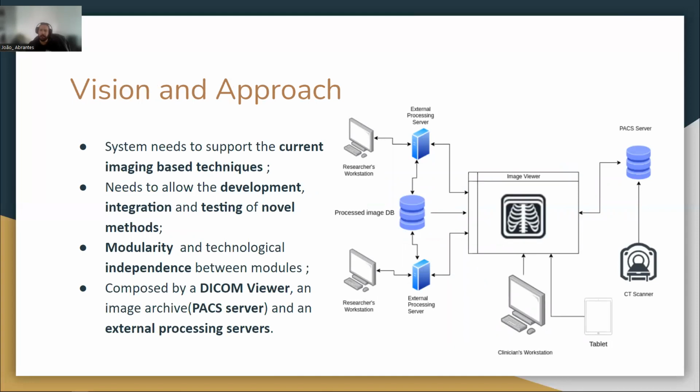Based on the modularity aspect reflected by the requirements definition, it was decided to explore solutions akin to a microkernel or a microservice software architecture, where each component is independent of the others and they interoperate through an API, or, in the case of a microkernel, where there is a core system in which each component acts as a plugin. The data storage service should work independently of the viewer, and more complex processing operations should be hosted in external services.